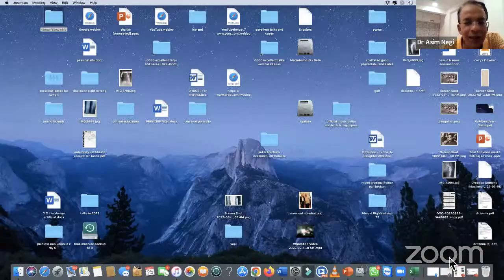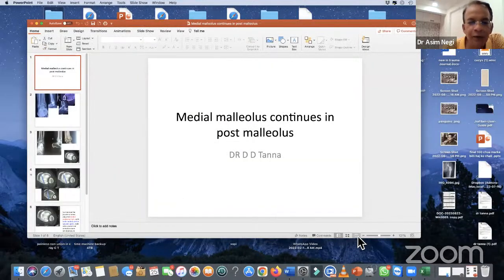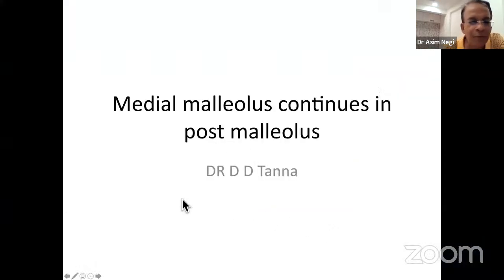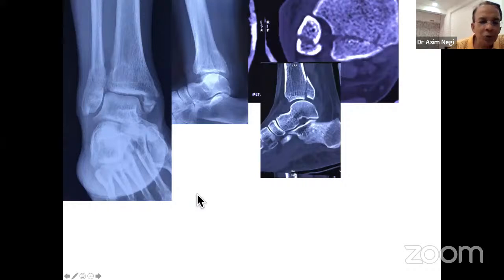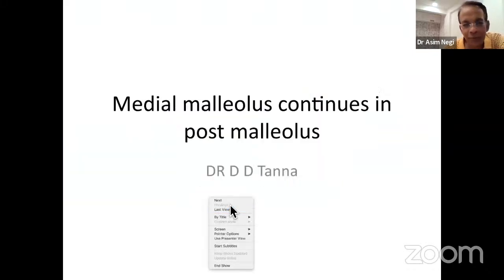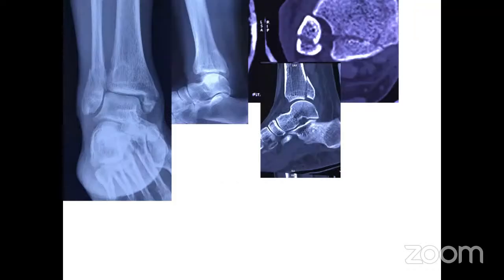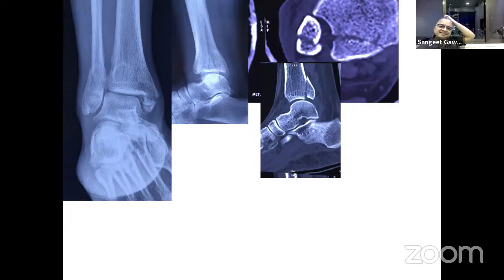Honestly speaking, with hindsight, I think I should have planned 2 incisions from the beginning. I was overconfident that I could see the whole fibula with my excellent posterolateral exposure. I can see from here to here, which is true, but that wasn't enough to take care of that rotational element. It wasn't good enough. So if you put 2 plates, they cannot dance. No, if you don't. No.